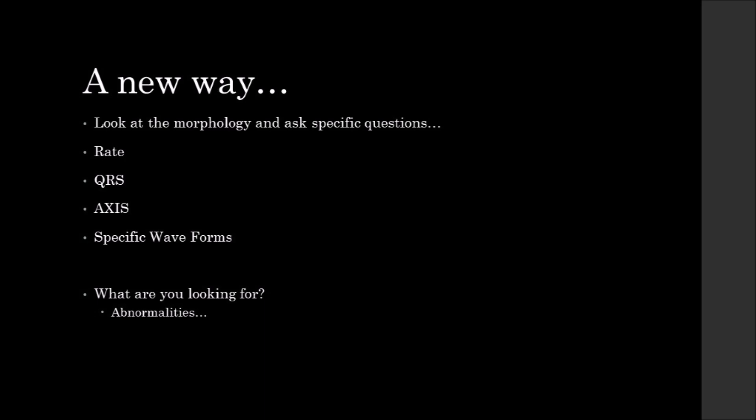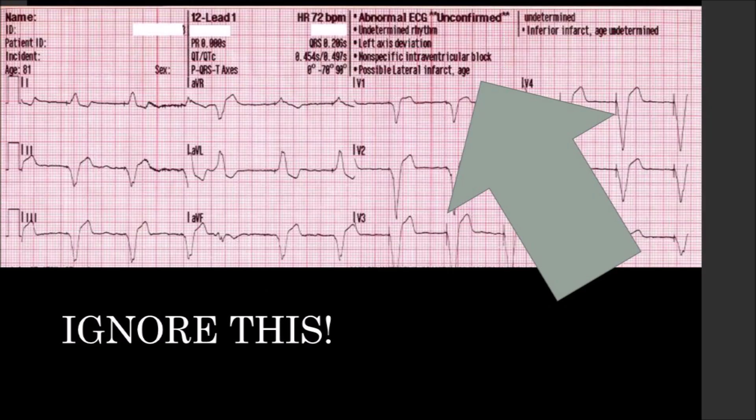Let's have a look at this EKG. This is a wide complex rhythm — we can see some pacer spikes in it, so we know pretty quickly this is a paced rhythm. But let's analyze it this new way. Do we see any specific crazy morphology? Yes. Just a general impression of the morphology shows us this is a heart that is malfunctioning in some way. Whether it's acute or whether it's planned, we don't really know yet — we're just looking for an abnormality.